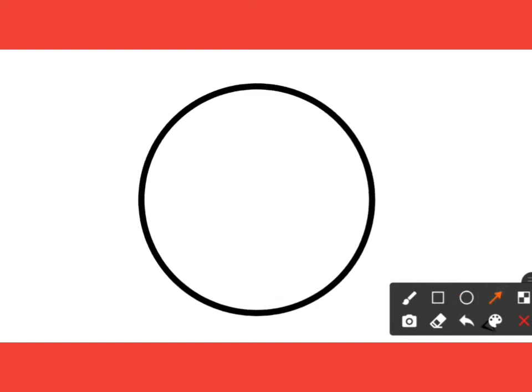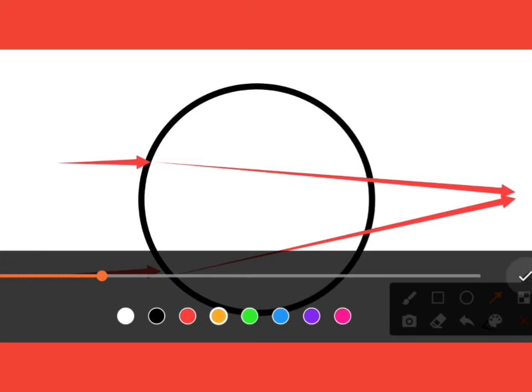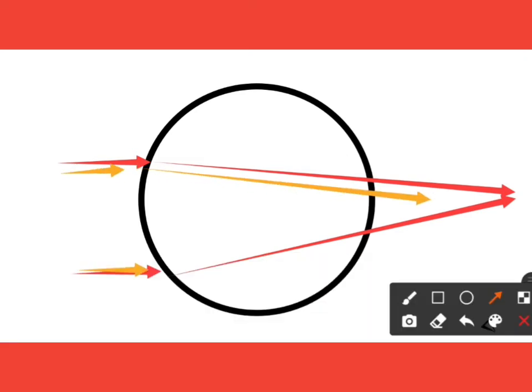Now what will happen in the case of a hypermetropic patient? From the definition, light rays are focused behind the retina. In an emmetropic patient, the red wavelength is focused behind the retina. So if the person has hypermetropia, this red wavelength will shift more backward. And the yellow will be focused behind the retina, because in an emmetropic patient it focuses on the retina.